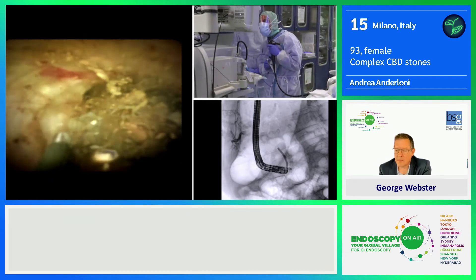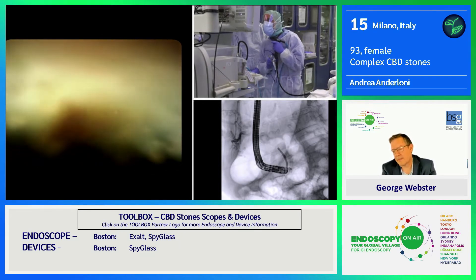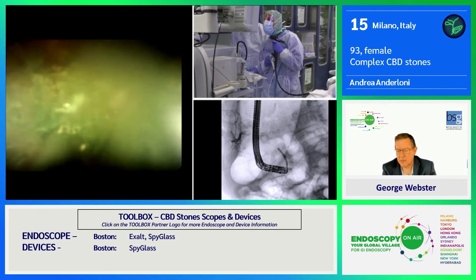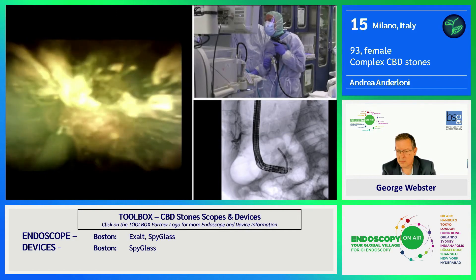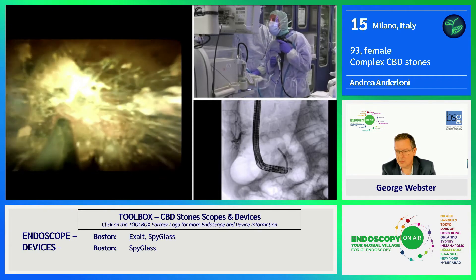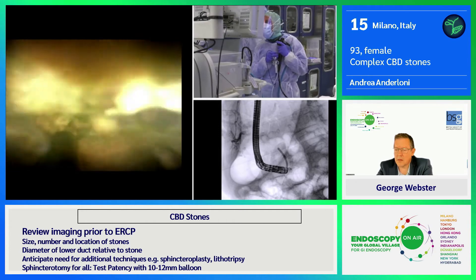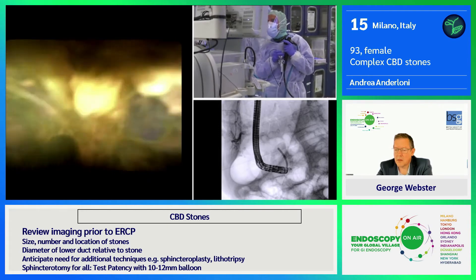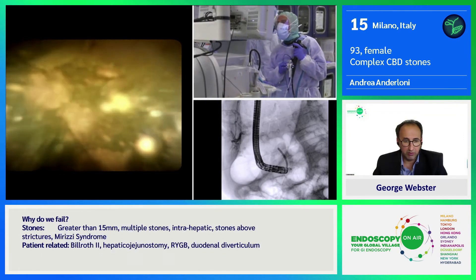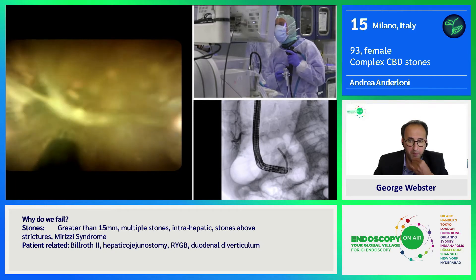You have different types of opportunity. This is one of them: electrohydraulic lithotripsy. As soon as you get in front of the stones, you apply some water and then you start firing. The fiber is working pretty well. It's very important to keep it away from your duodenoscope and from your Spyglass scope in order to reduce the risk of damaging.